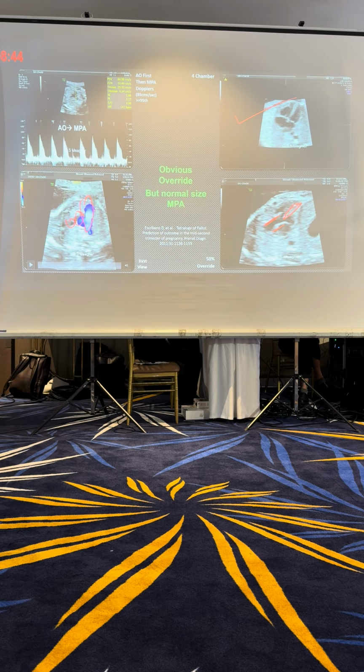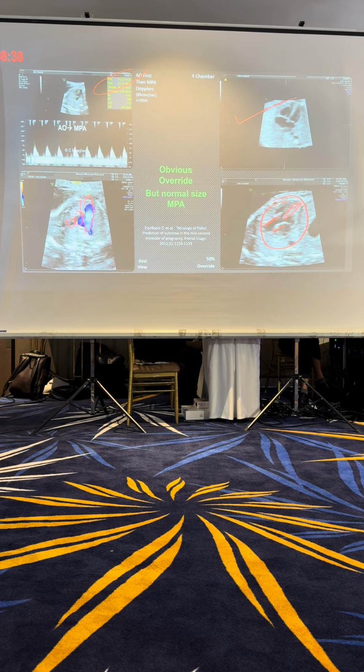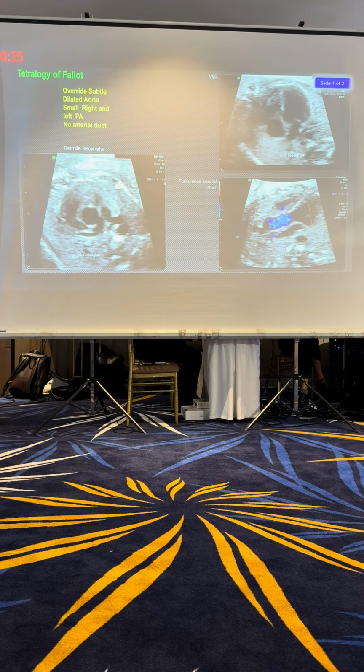I say, is this another VSD? No, this has to be Fallot's. Then I do a pulse Doppler gate, and I get velocities which are greater than 100 centimeters a second. That baby has got tetralogy of Fallot. So you understand there's a spectrum I'm walking you through. In each case, it's going to get worse and worse, and you need to understand the steps you need to take to distinguish between them.